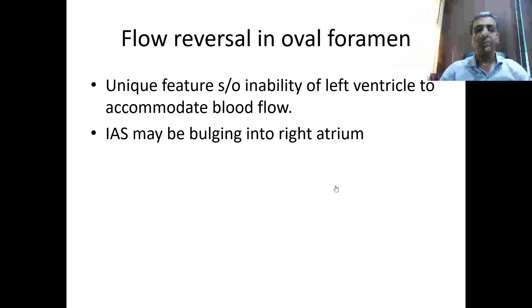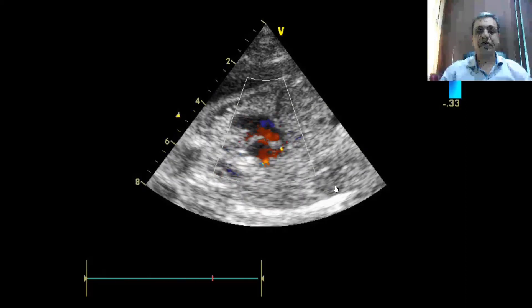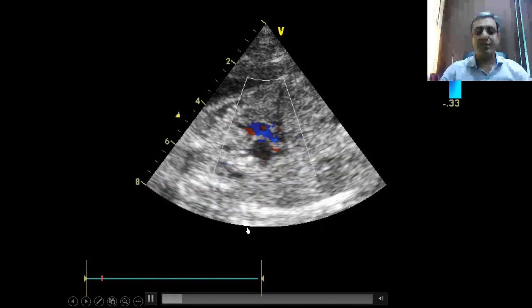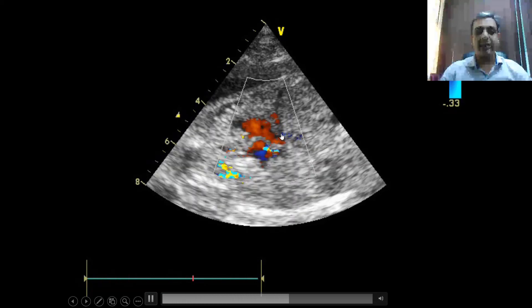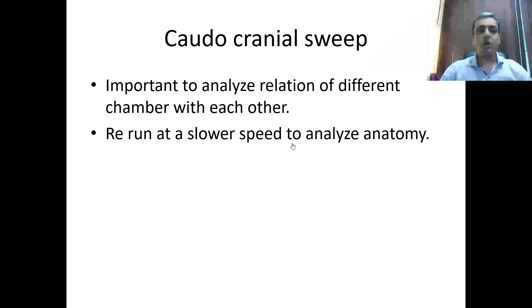Flow reversal in the foramen ovale suggests inability of the left ventricle to receive blood, with increasing left atrial pressure causing left-to-right flow across the foramen ovale, and the interatrial septum may be bulging into the right atrium. Normally the interatrial septum bulges into the left atrium. In this case, there is flow reversal from the left atrium into the right atrium with the interatrial septum bulging into the RA. Also visible are the superior vena cava and inferior vena cava.